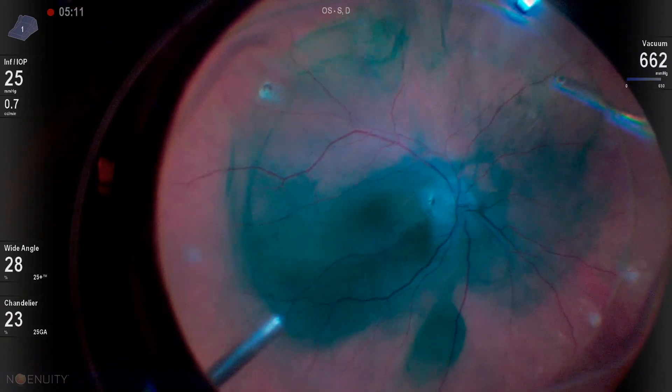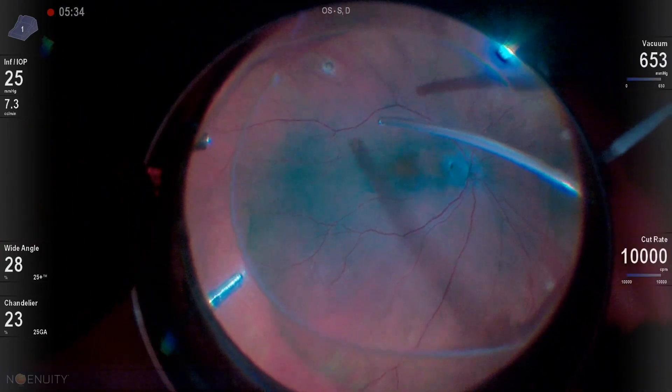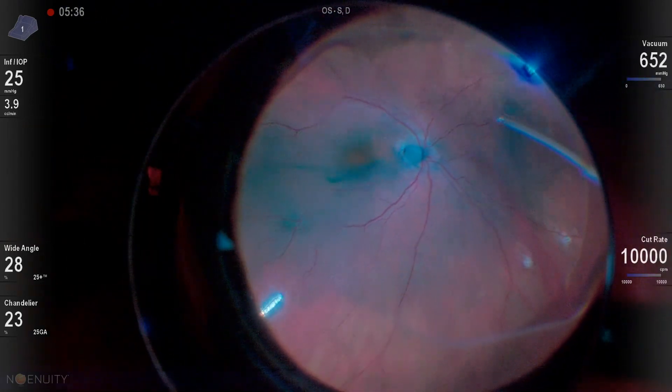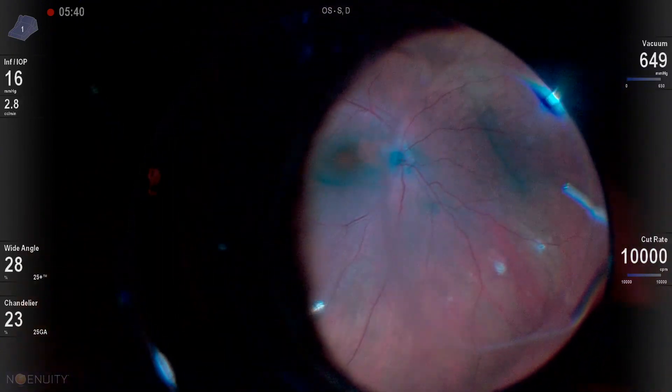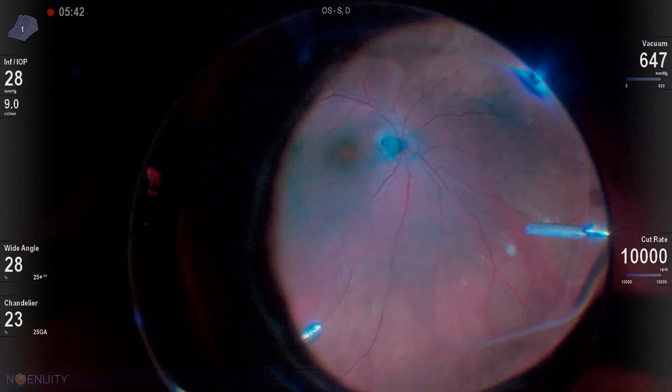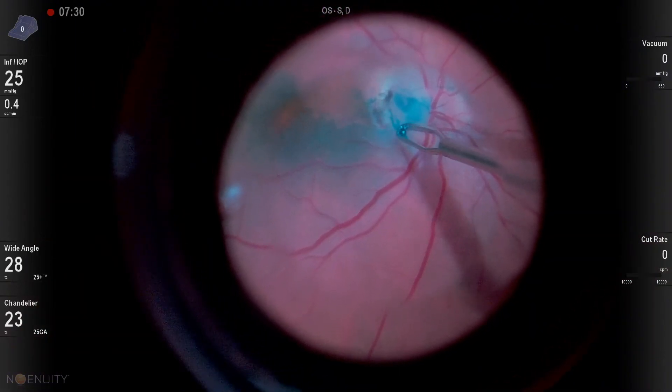Here you can see that up-and-out motion that I love to use to get the PVD with the cutter. Gets it up off of the nerve, and then I just use the fluid to help dissect the rest of the vitreous up and off by cutting. I don't have to go back down and pull excessively in many cases.